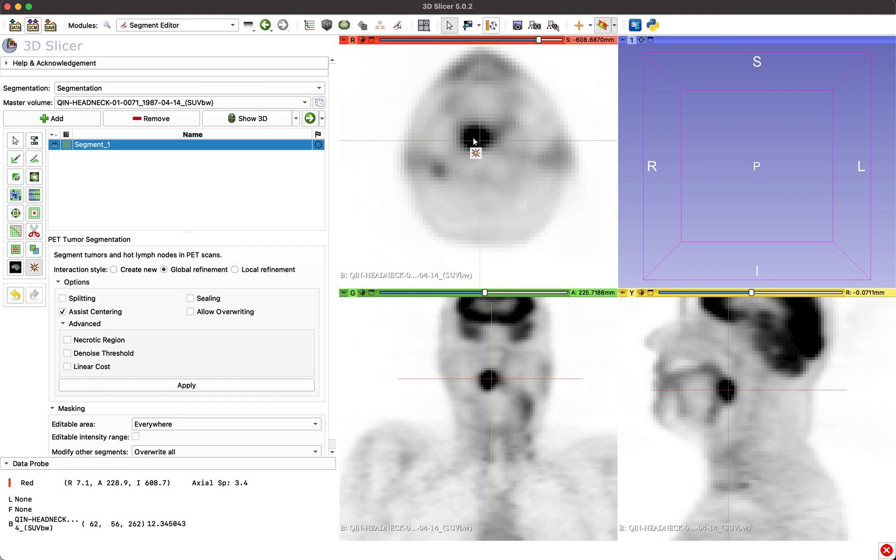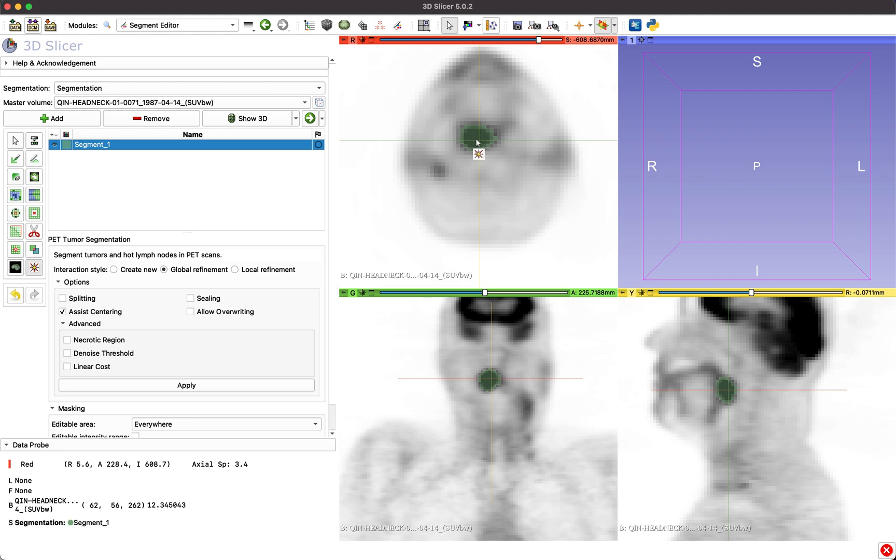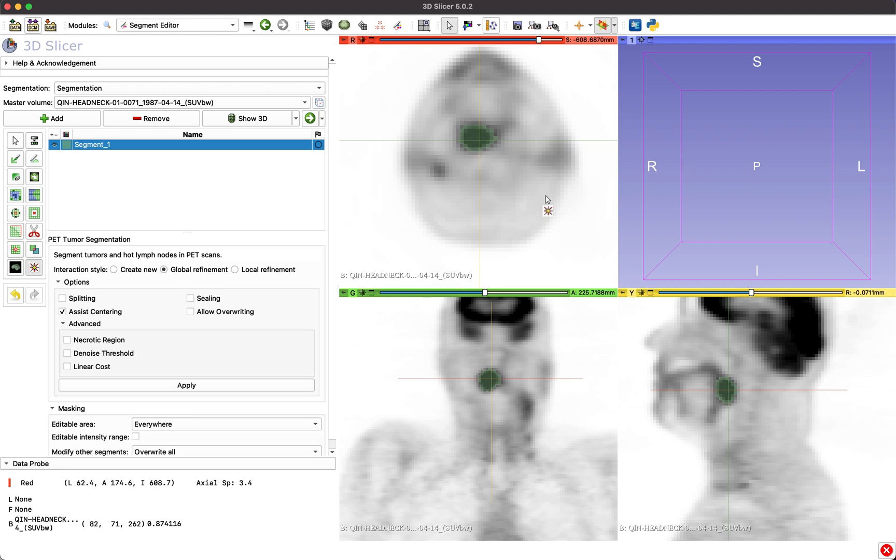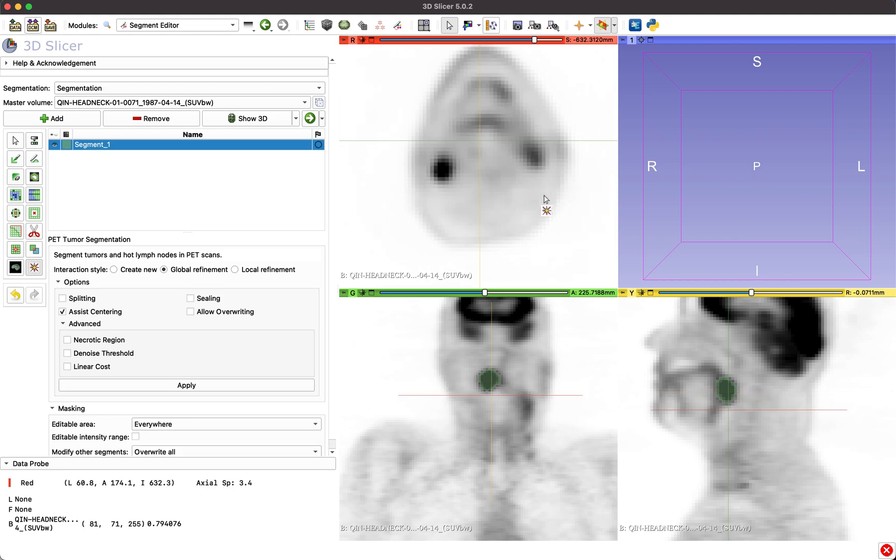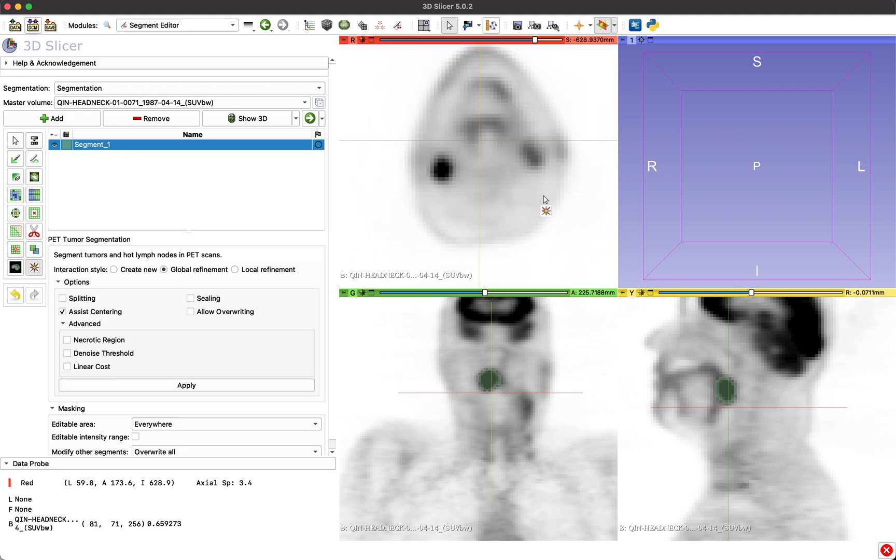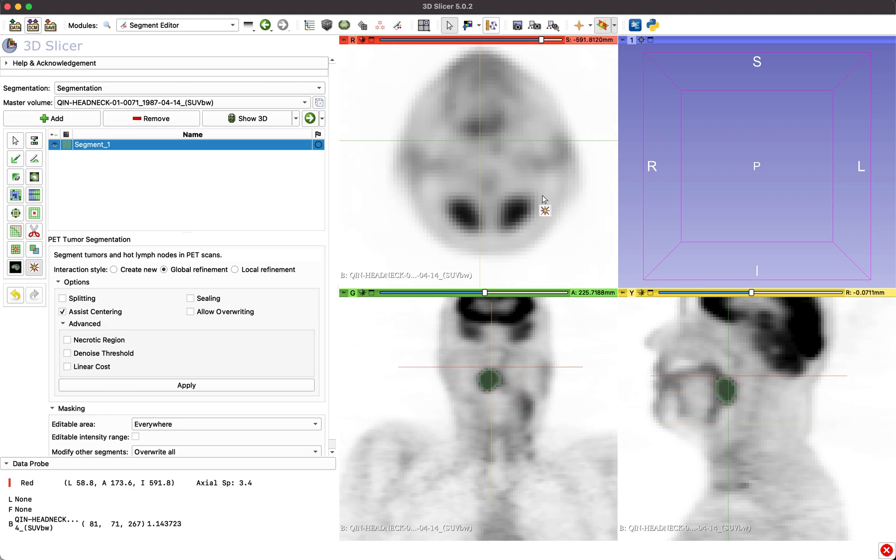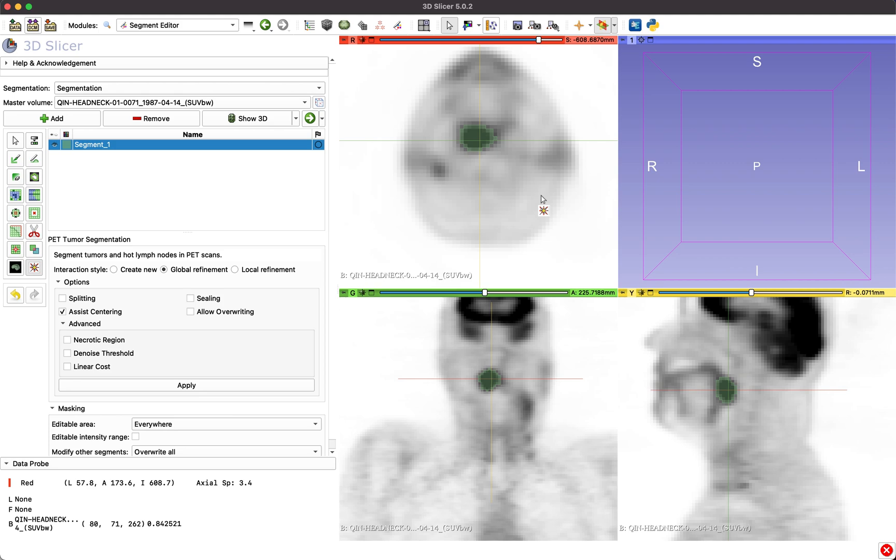Now, click approximately on the center of the lesion in any of the three slice planes. The algorithm will automatically generate a three-dimensional segmentation. The user should verify the segmentation by scrolling through all the slice planes covered by the lesion.